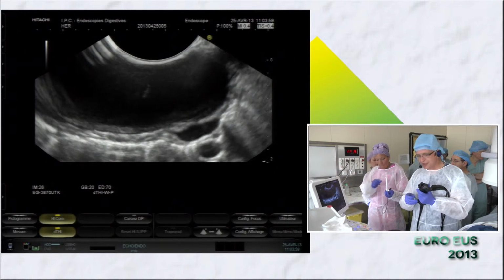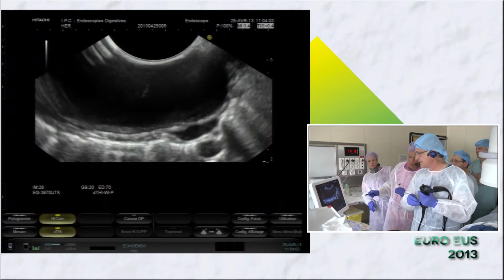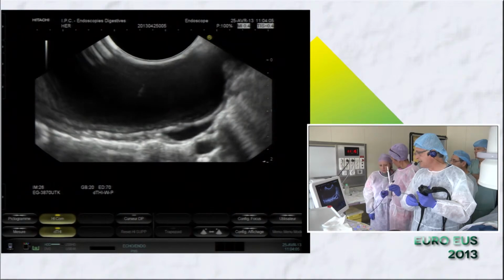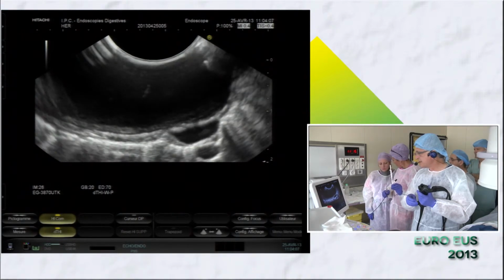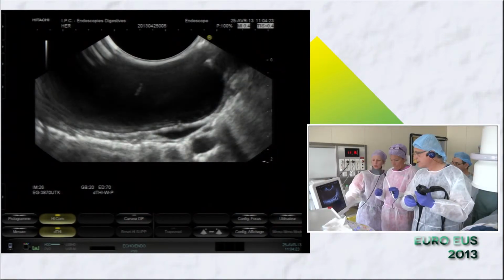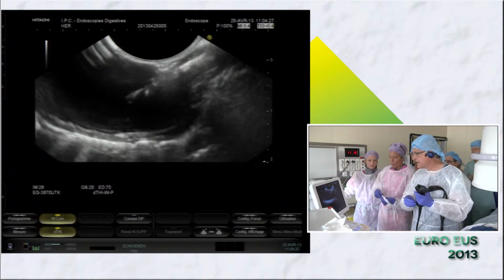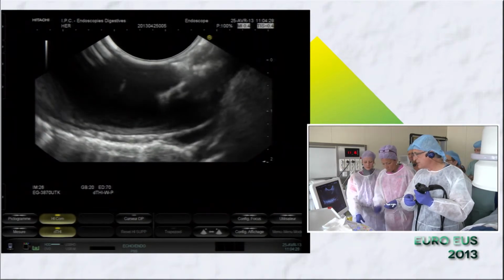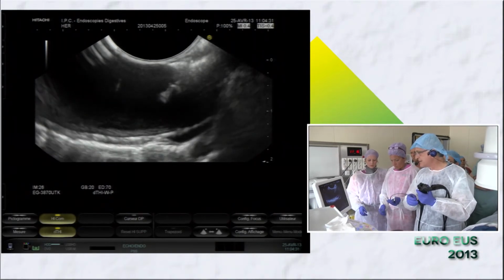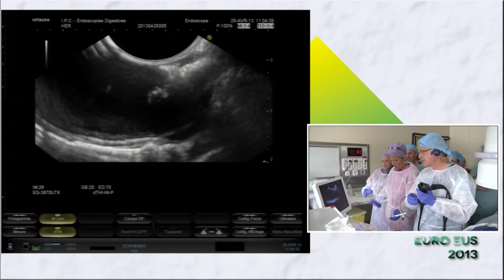When you use the cystotome, I always prefer to use it in pure cut, especially when you dilate the entrance. You see the tip of the needle. And now we are inside. But it's not floating, you see, Mark? It looks to be a kind of thing which is semi-solid.